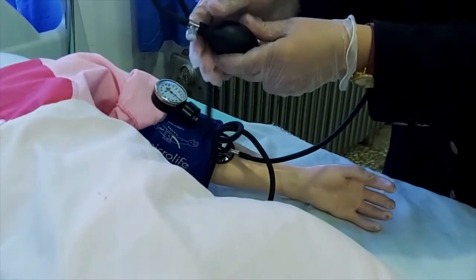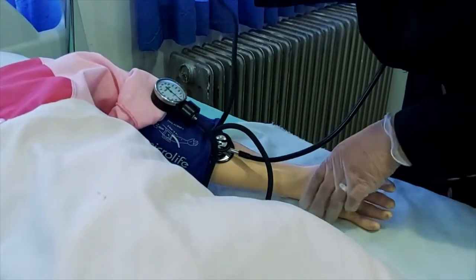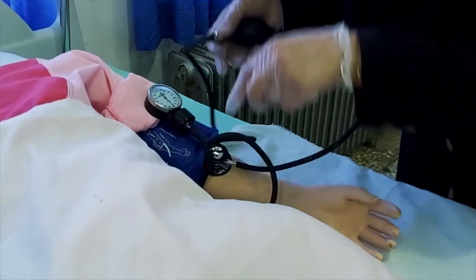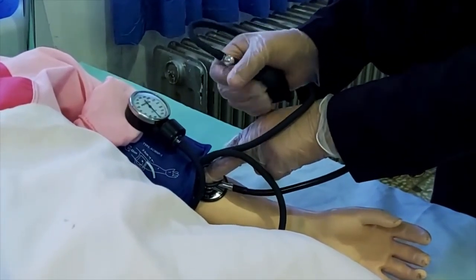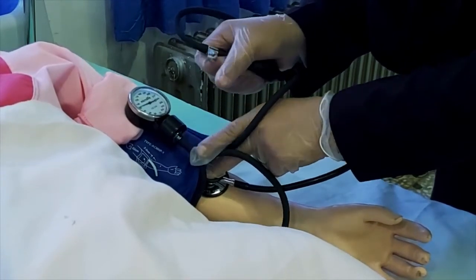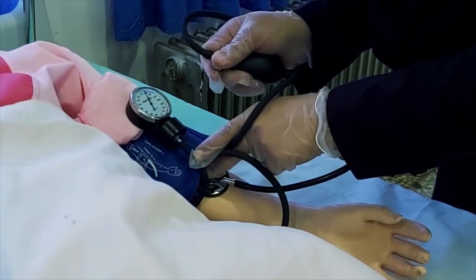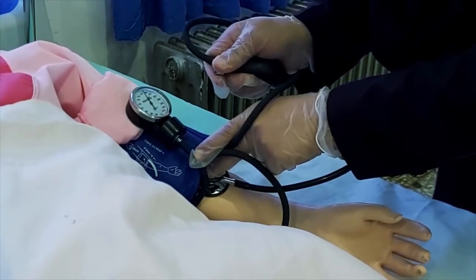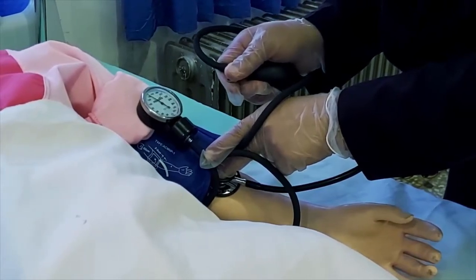پیچ روی حباب لاستیکی را کامل می‌بندیم. با حرکات یکنواخت و مستمر، در حالی که به مانومتر نگاه می‌کنیم، شروع به پمپ کردن می‌کنیم تا اندازه سی میلیمتر جیوه بیشتر از زمانی که صدای توی گوشی قطع می‌شود. سپس پیچ را به آرامی در خلاف جهت عقربه‌های ساعت باز می‌کنیم.